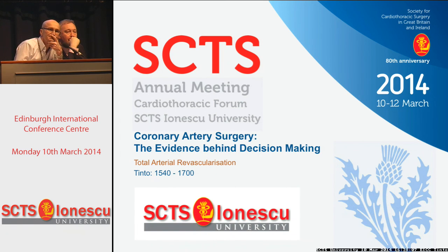I really agree with that, Prof. But if you're in a situation where you put a vein graft on a moderate lesion, or what the cardiologist told you is a significant lesion, and now you've done a TTFM, let's say 10% of the lesions are going to show that there is a problem with our graft. In the borderline territory where you've got a bit of backflow, that's because of competitive flow. You're in a situation where you're grafted and you know the graft is going to go down probably. It's going to be in that 10% of grafts that block. Is there anything you can do to fight that?